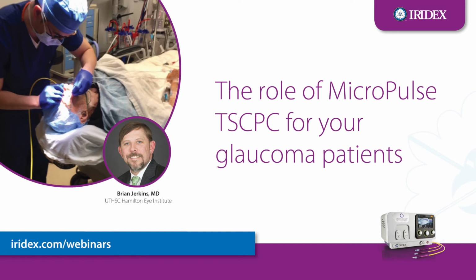pressure where we want, and then there's the other 50%, a significant amount of those are going to need potentially a second treatment. And then there's a small percentage, like many glaucoma procedures, where we just have to try something else. So I do think there was probably a fair amount in that first group when I was in my learning curve of more how to do the technique that would have had some more treatments. But currently, I cannot remember the last time I had to retreat on a MicroPulse.